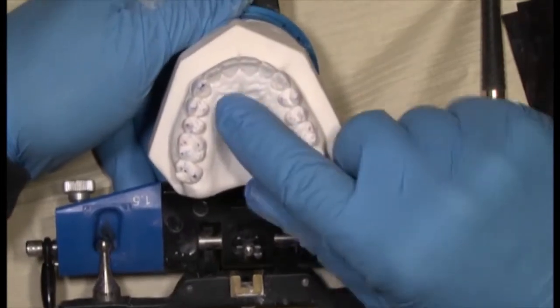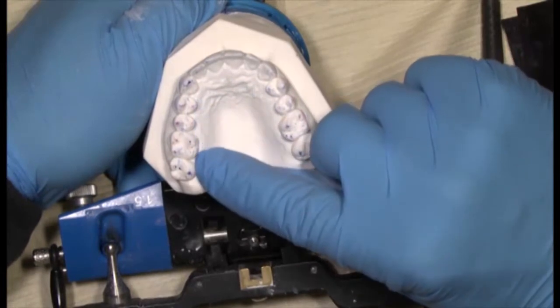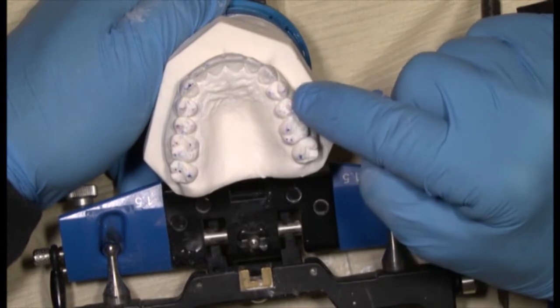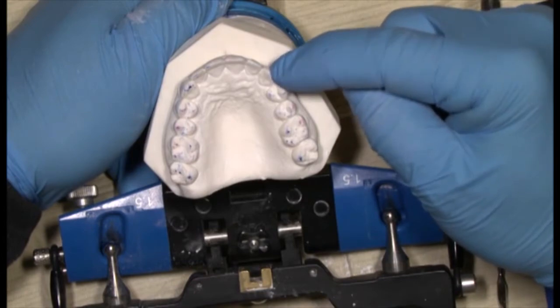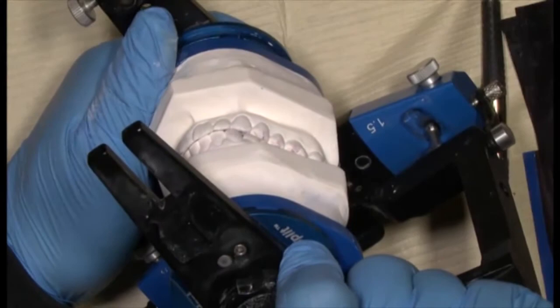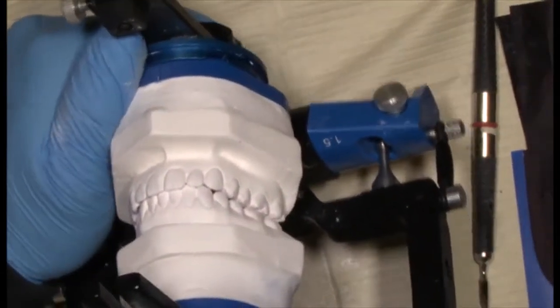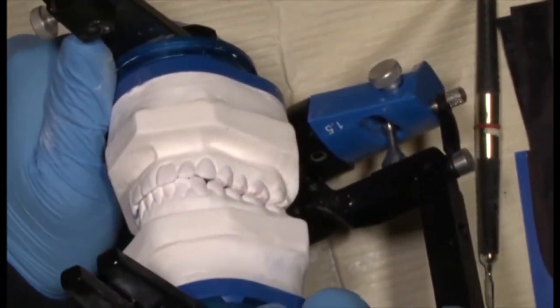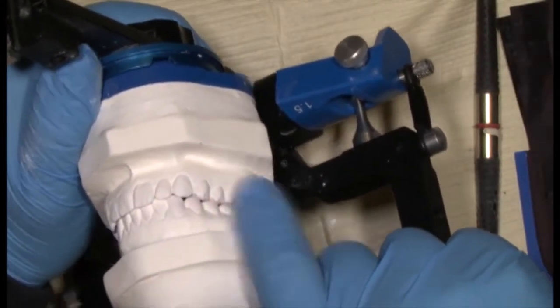Now, for the first time, we can see this right cuspid coming into contact. We have contact on all the teeth on this side. We have both molars, a light contact here, a light contact here, and not a contact on this left cuspid. It's very close, as you see. Now we have to decide what we're going to need to do to get it into contact in the mouth. In other words, if it looks like it's too tight in the front or behind the anterior teeth, this may be as far as I'll take this.